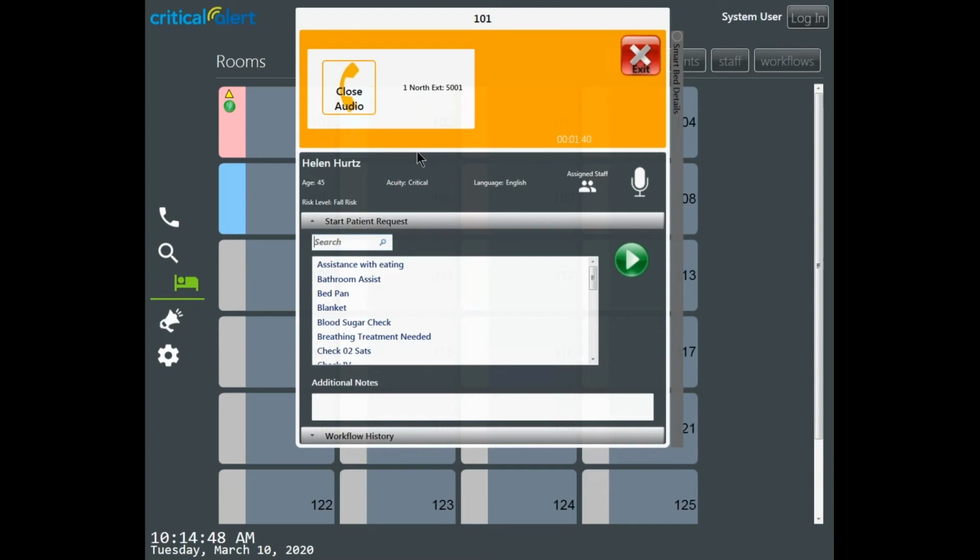So the hardware still stays. If there's nothing wrong with it, we can keep it another 5, 10, 15 more years. Now, if the hardware is failing, that's another issue, and as Courtney pointed out, that's where we can come in and start displacing the equipment as needed. But in this case, I'm just utilizing that legacy Rauland 4 nurse call hardware and adding some additional features to that.